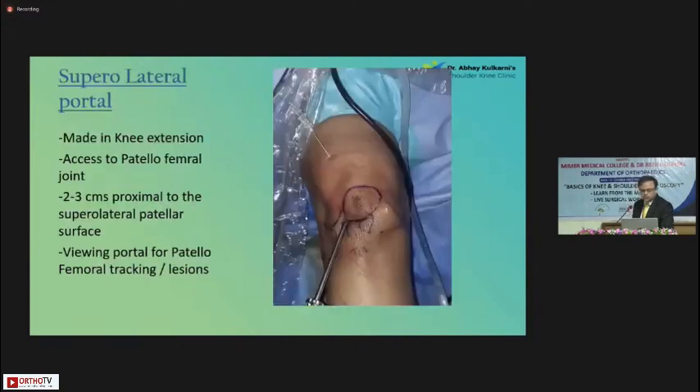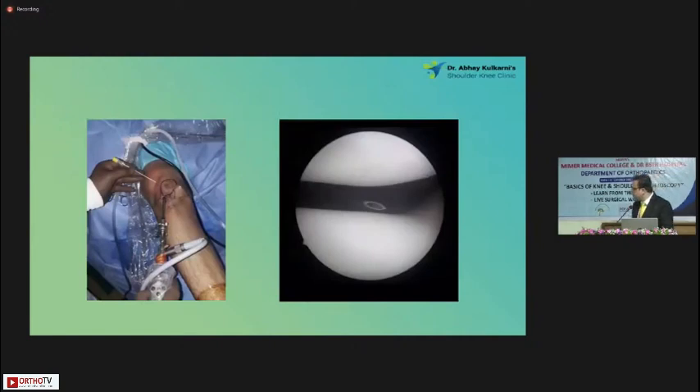We come to the last portal — we are not considering posteromedial, posterolateral, or other complicated portals here because it's a basic knee workshop. This is for viewing the patellofemoral joint. We get the knee in extension for this marking — the patella is actually here because I've extended it; the marking was done in 90 degrees of flexion. So this is around two to 2.5 centimeters above and lateral to the patella — this is the superolateral portal. I'm making this portal and you can see the needle coming in.